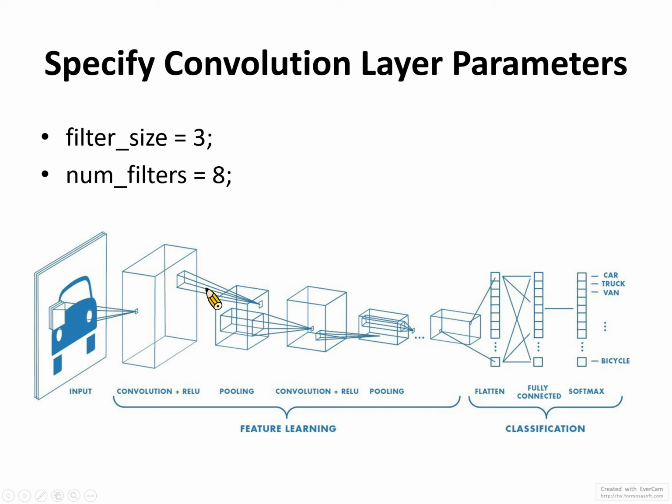These convolution layers need to define the filter size and how many patterns you want to generate from these different filters, different patterns of the 0-1 patterns. For simplification purposes, we just use 3 and 8. Then we follow this parameter to build a series of convolution and pooling layers in the next step.